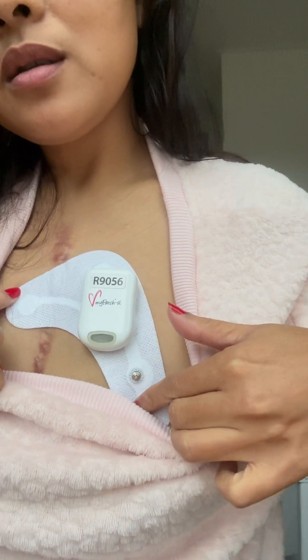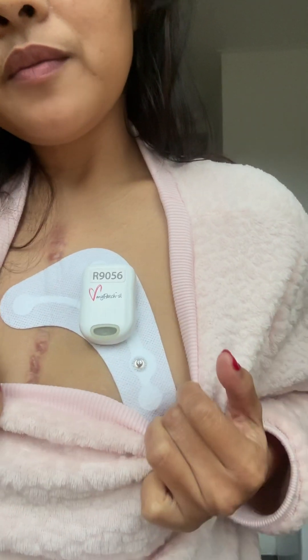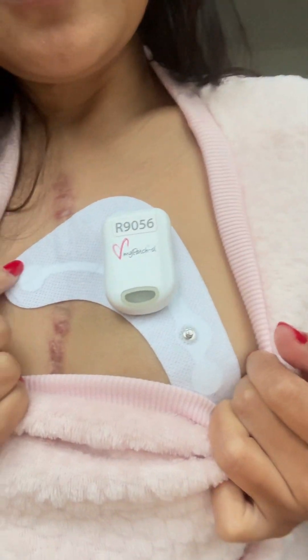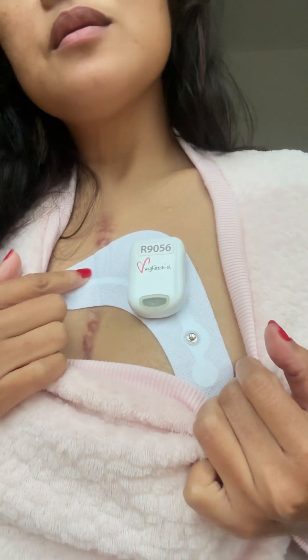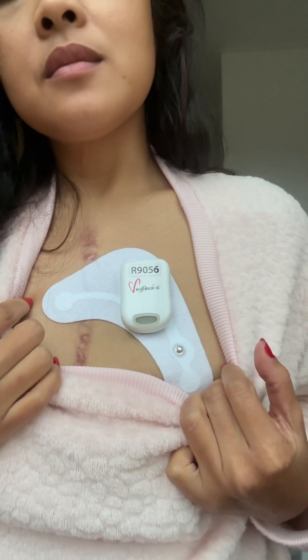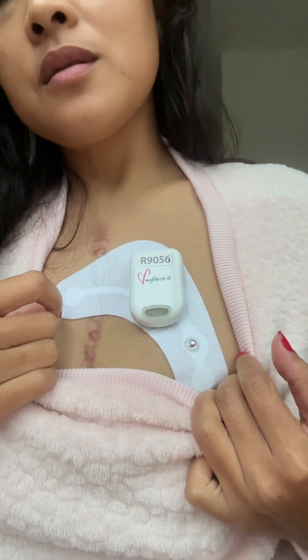Today, I'm going to show you the new model of Holter Monitor from MyPatch SL. This is a revolutionized model. It is very convenient, lightweight, and wireless — as you can see — and waterproof, so you can shower with it.